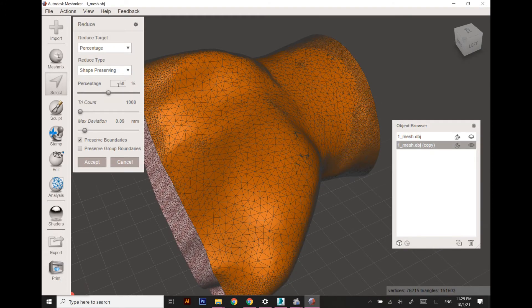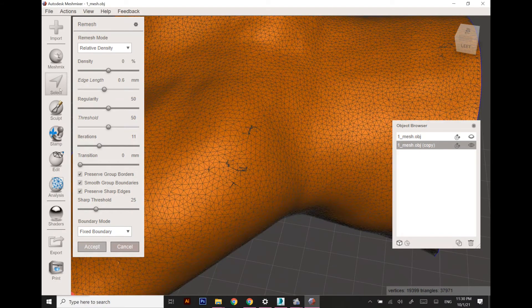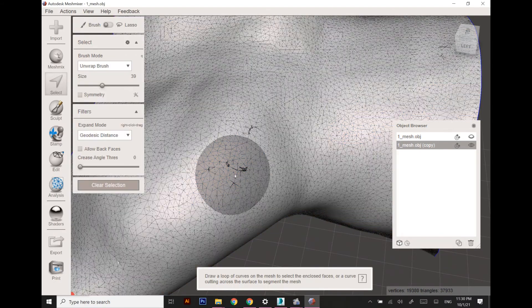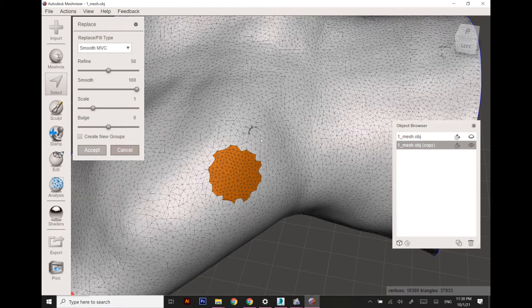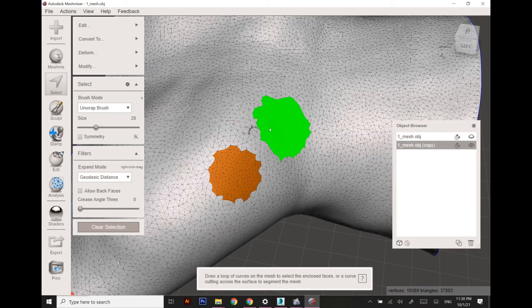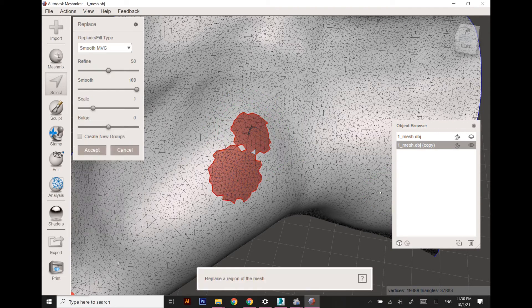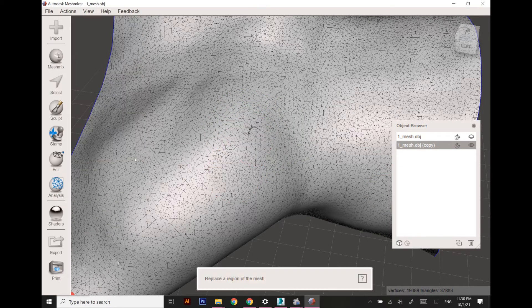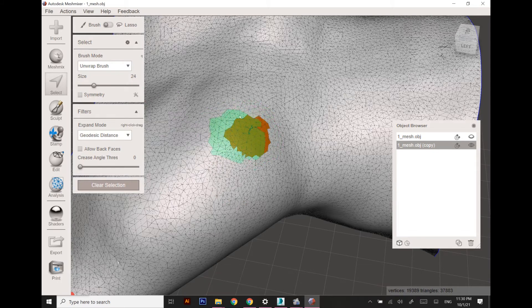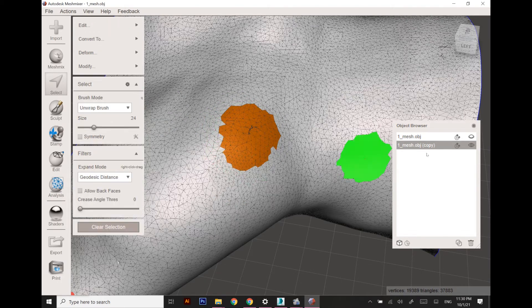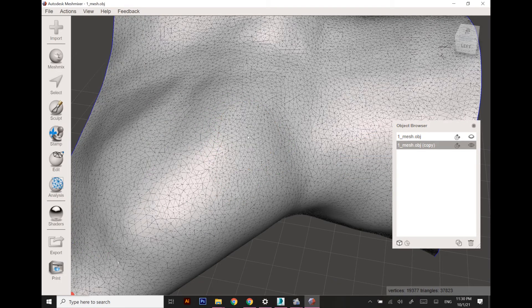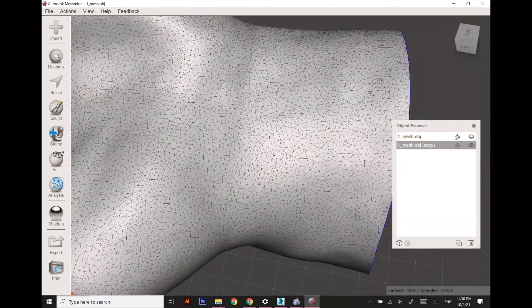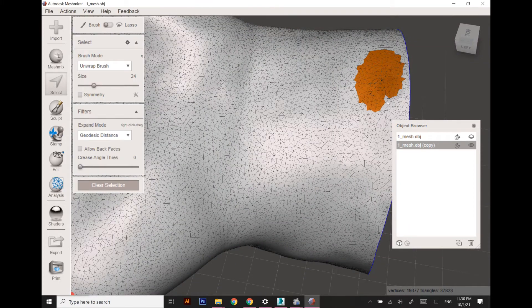As you can see, the polygons are randomly distributed so we are going to rectify this. There are some particular problems in polygons, so we are going to fill the defected areas.